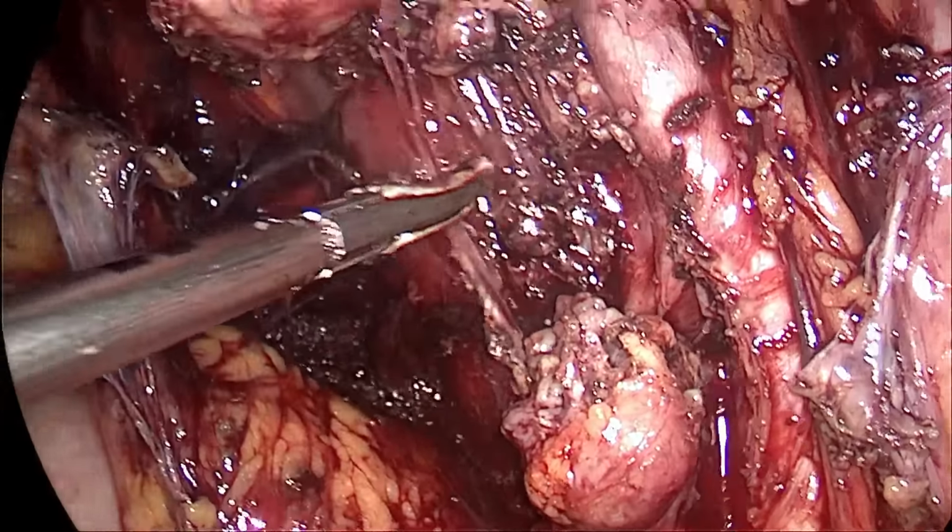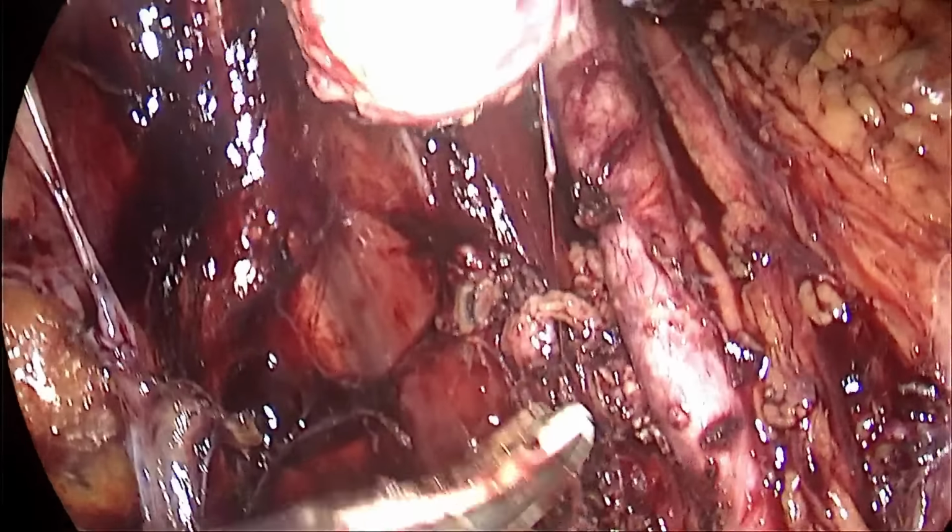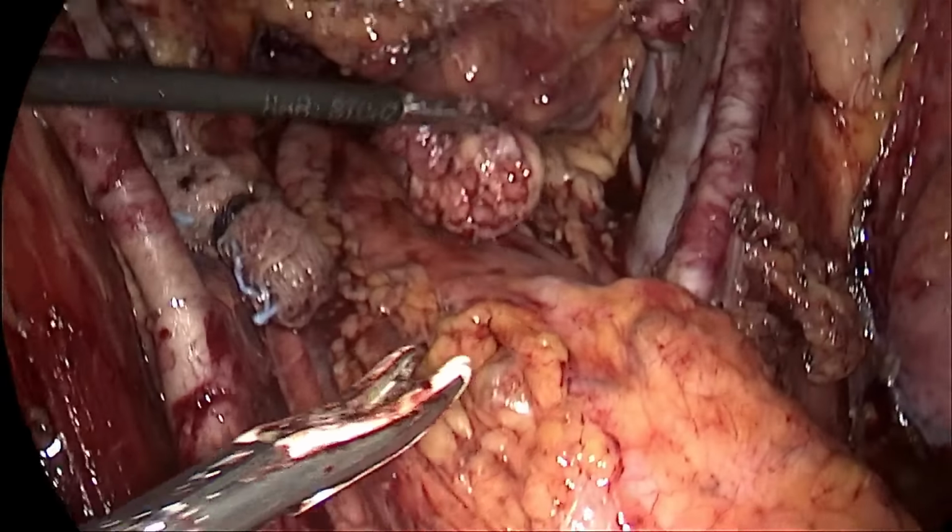That's one large node from the left para-aortic group.